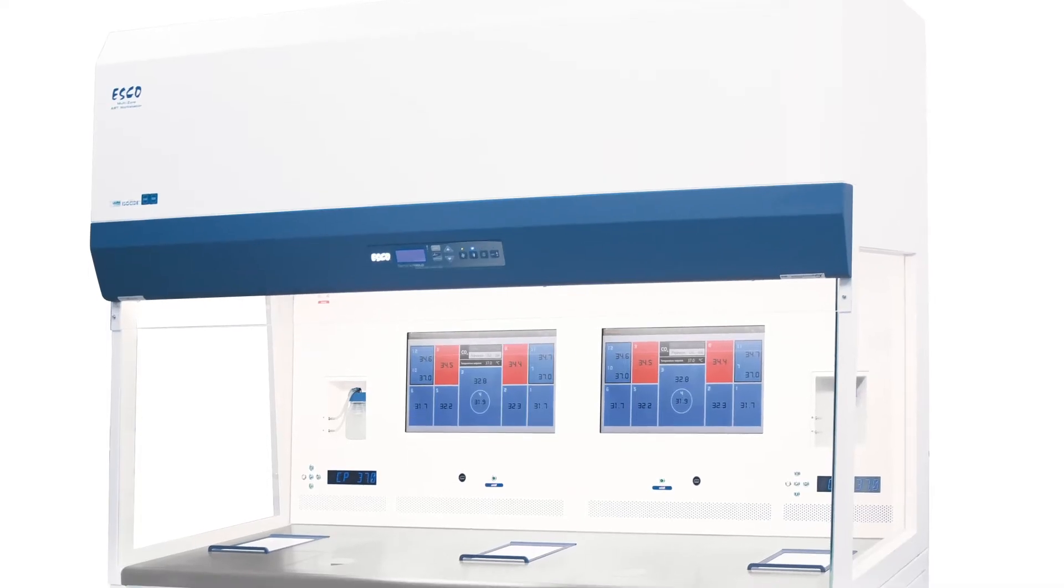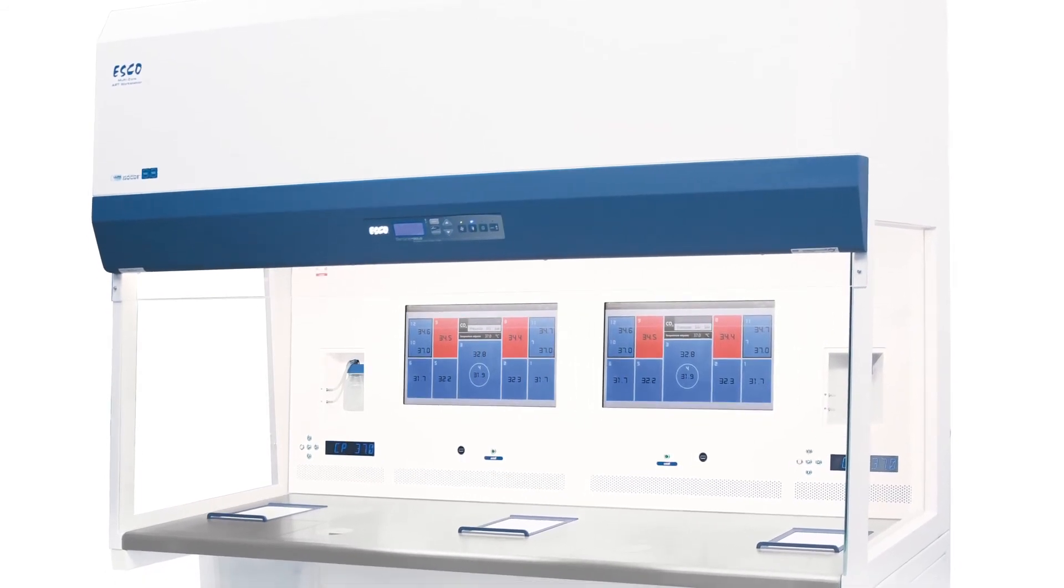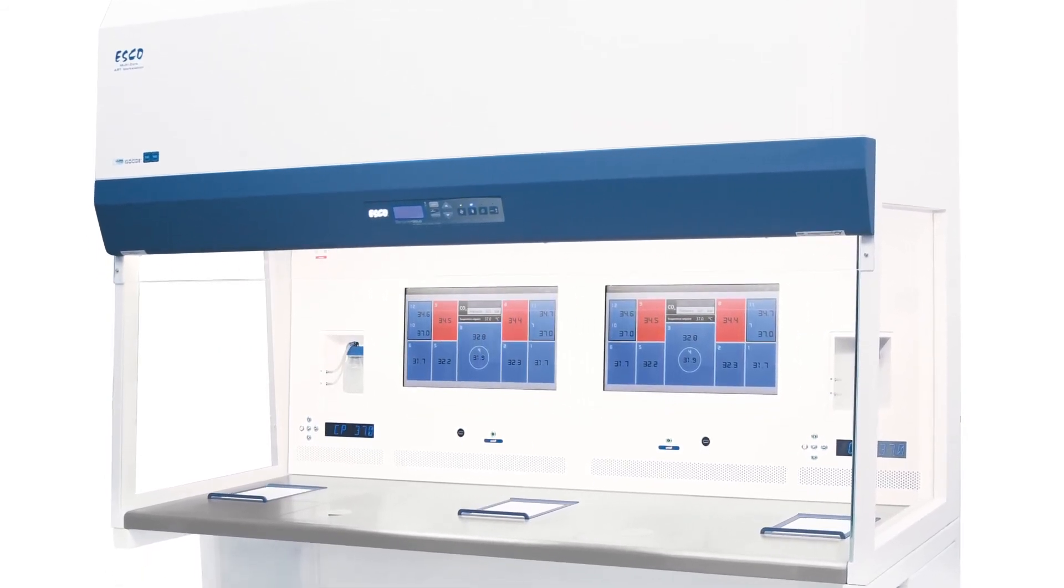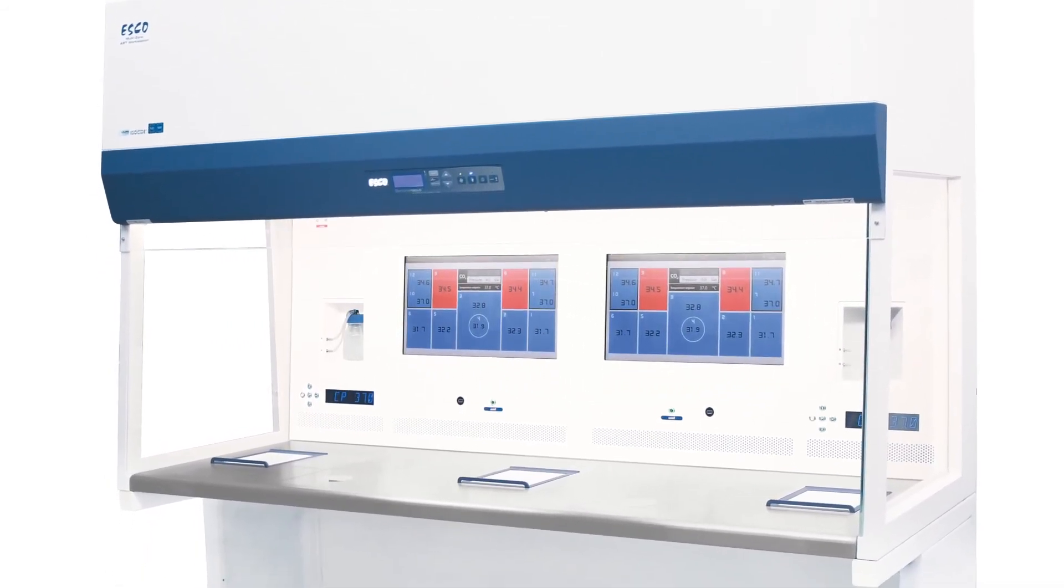ESCO Multizone ART Workstation has it all. Undeniably, it is at the top of its class. Want to add ESCO Multizone ART Workstation on your IVF lab? Contact us.